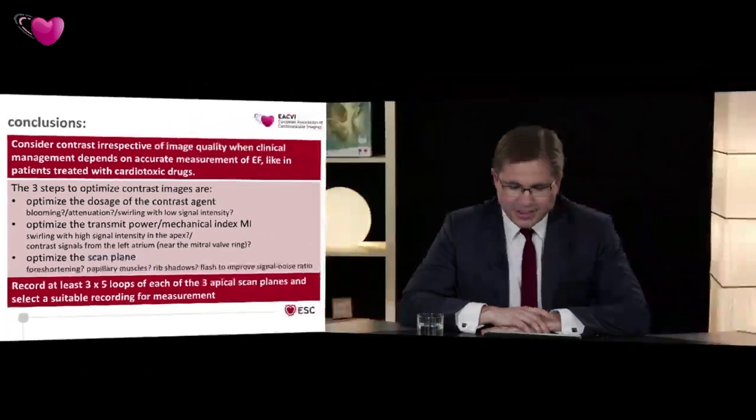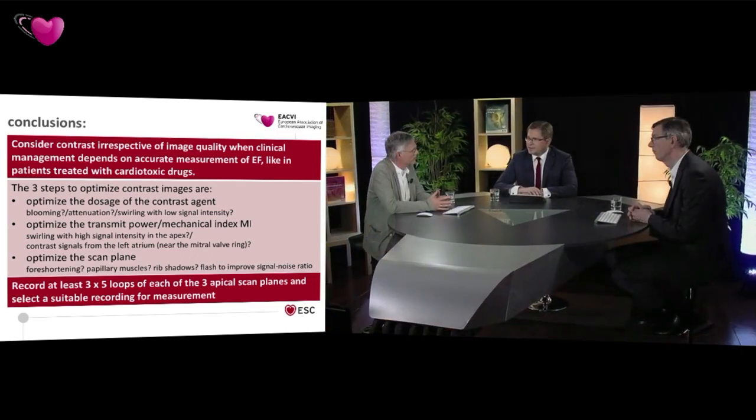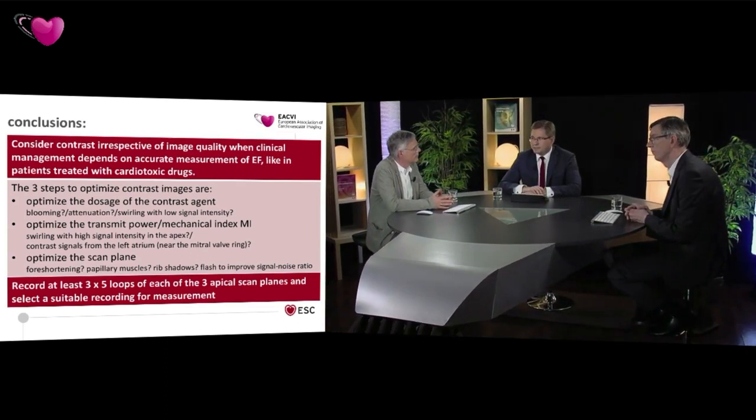Thank you for this impressive presentation. We have questions coming in. I have one question of my own related to the last slide, recording at least 3 times 5 loops of each of 3 correct apical scan planes. It may take some time. So some of the institutions, some of the people performing contrast echo use triplane imaging, multiplane imaging, in order to shorten this time and to assess LV volume and function this way. What's your opinion about that?